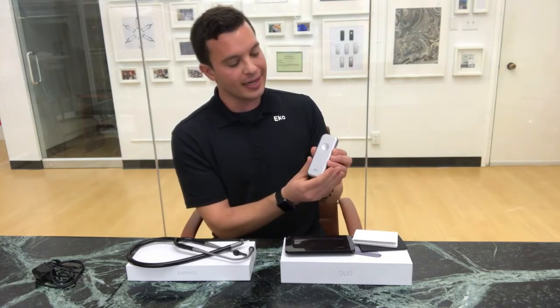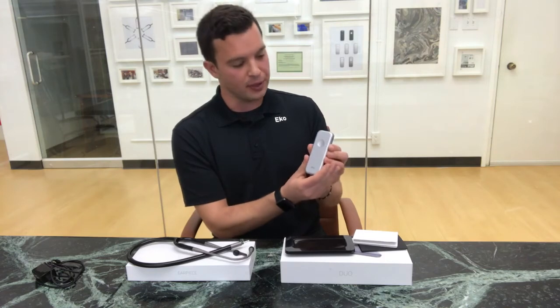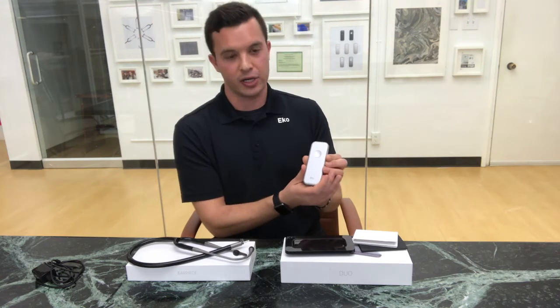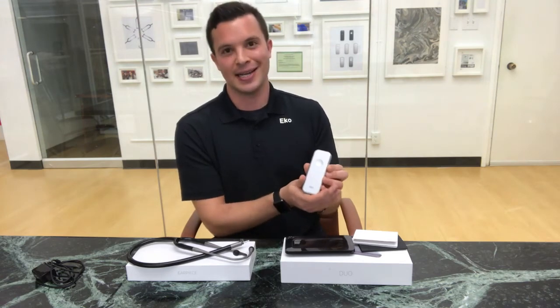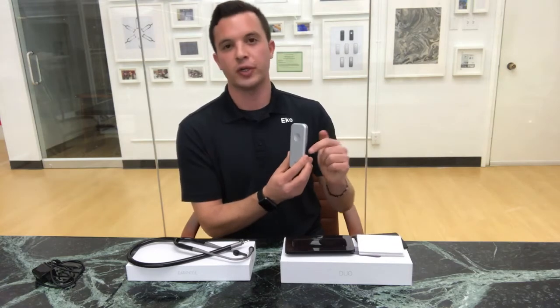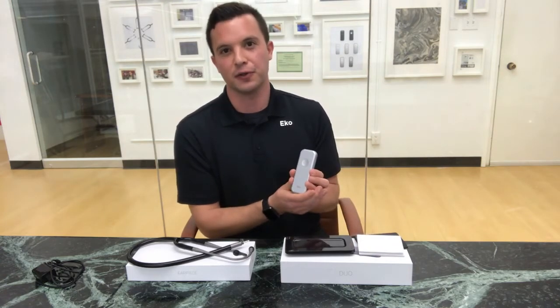The 12 o'clock is the diaphragm, which is the default mode. The three o'clock is the bell mode, the six o'clock is the mid-range, and the nine o'clock is the extended mode. Refer to your quick start guide to remind you of each one of these positions and the associated filters.